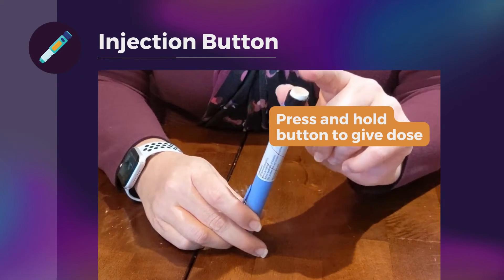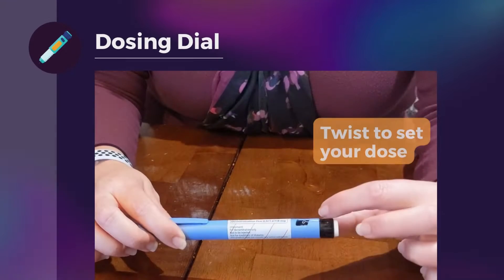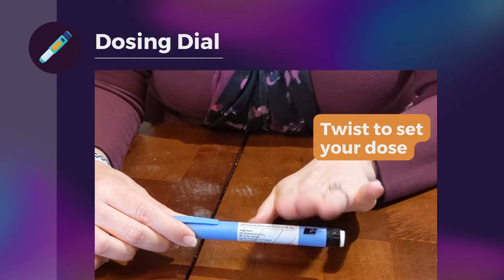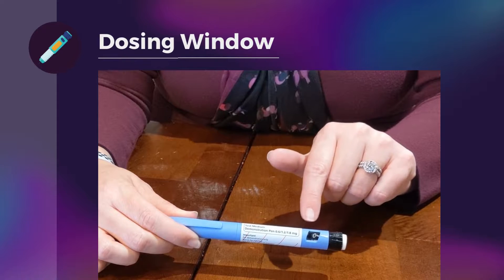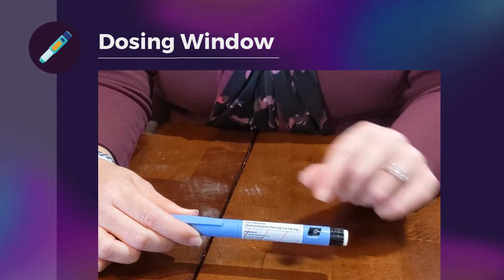Here we have the injection button — this is what you'll press when you want to give your dose. This black portion is what you'll actually twist when you want to move from zero to your dose. The next thing I want you to pay attention to is this dosing window; we're going to talk about that a lot moving forward.